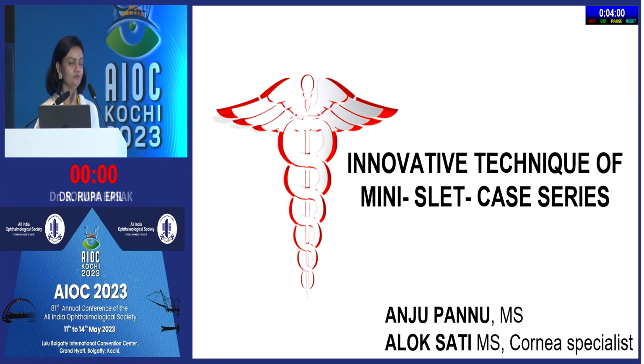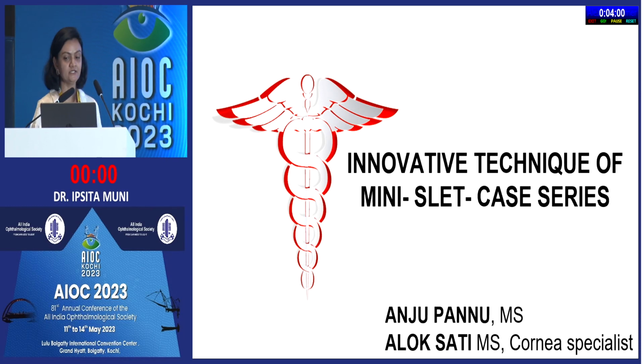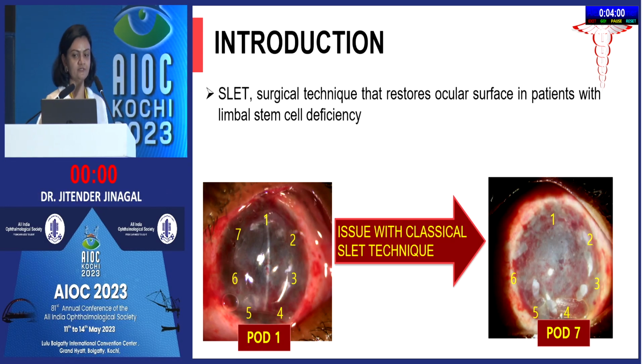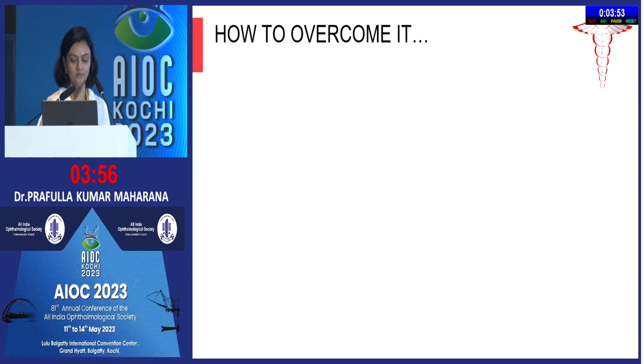Good morning, everyone. Today I'm presenting an innovative technique of mini SLET, a case series. Simple limbal epithelial transplantation is a surgical technique that restores the ocular surface in patients with limbal stem cell deficiency. But one of the very common issues with the classical technique is displacement of the limbal pieces. So how to overcome it?